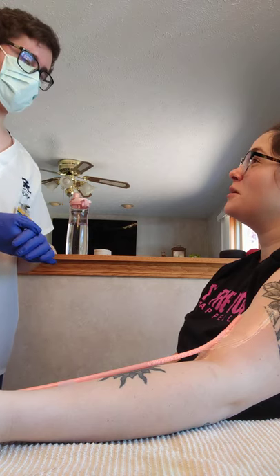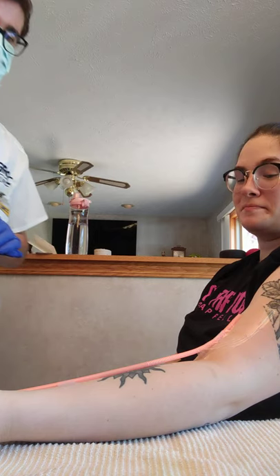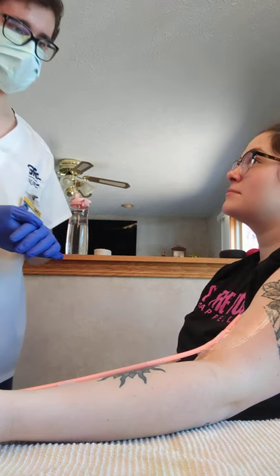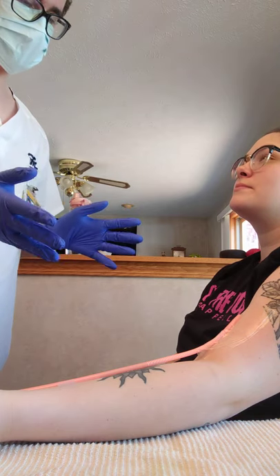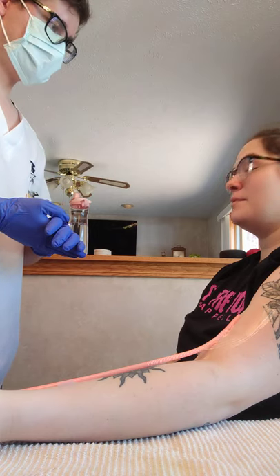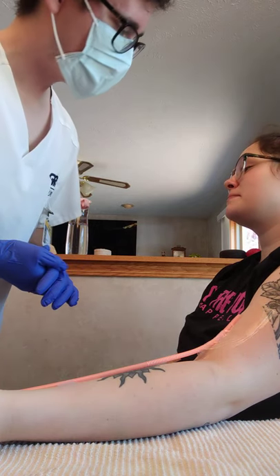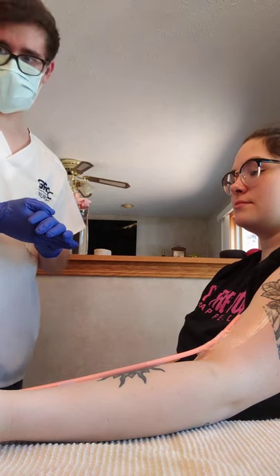My name is Samantha Ober, and I was born May 15, 1993. Great. All right, well, to start off, I'm going to look at your catheter and look for any redness or swelling. Have you had any pain around the catheter site? No, I haven't. All right. Looking at your jugular vein, I don't notice any distension.